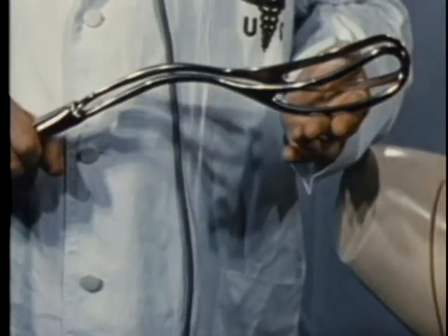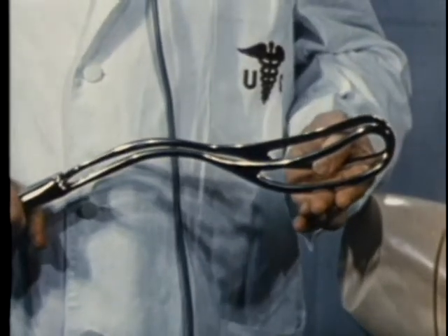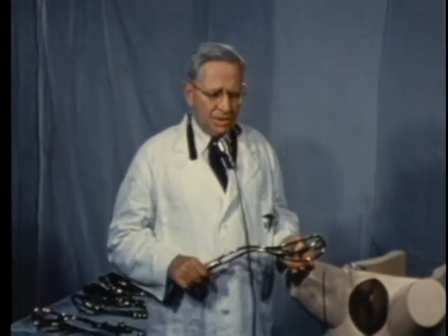In 1924, the late Edmund B. Piper of Philadelphia presented this instrument, which is intended for the aftercoming head and is not to be confused with his instrument, the two-piece axis traction forceps, intended for the forecoming head.